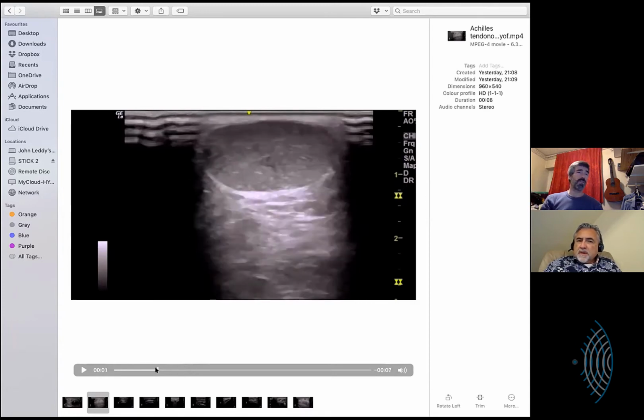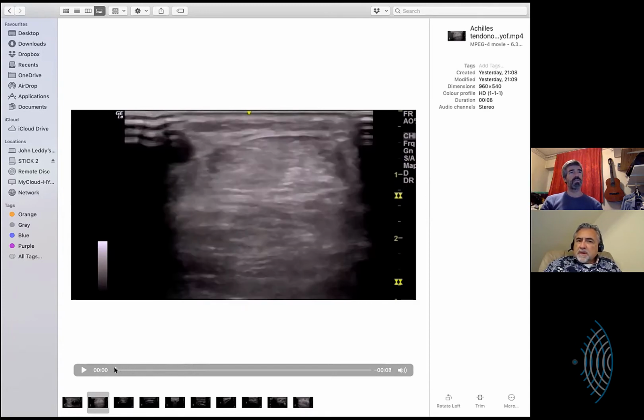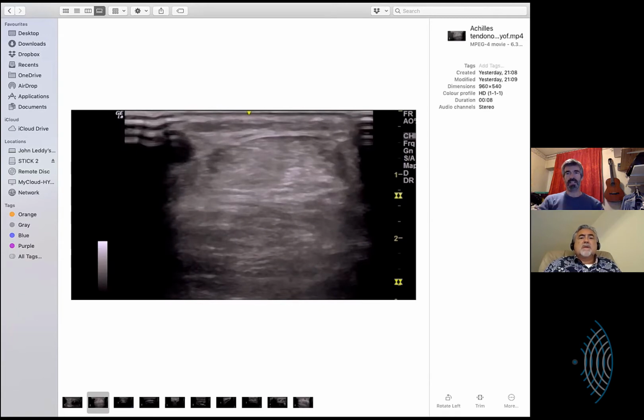Now, we'll talk about it another time, but when you look back, if you go up the aponeurosis of the Achilles, one of the things I'm looking for as I go up is the point at which there are clearly two layers. First of all it flattens out into one thick, solid piece, like you're rolling out pastry.